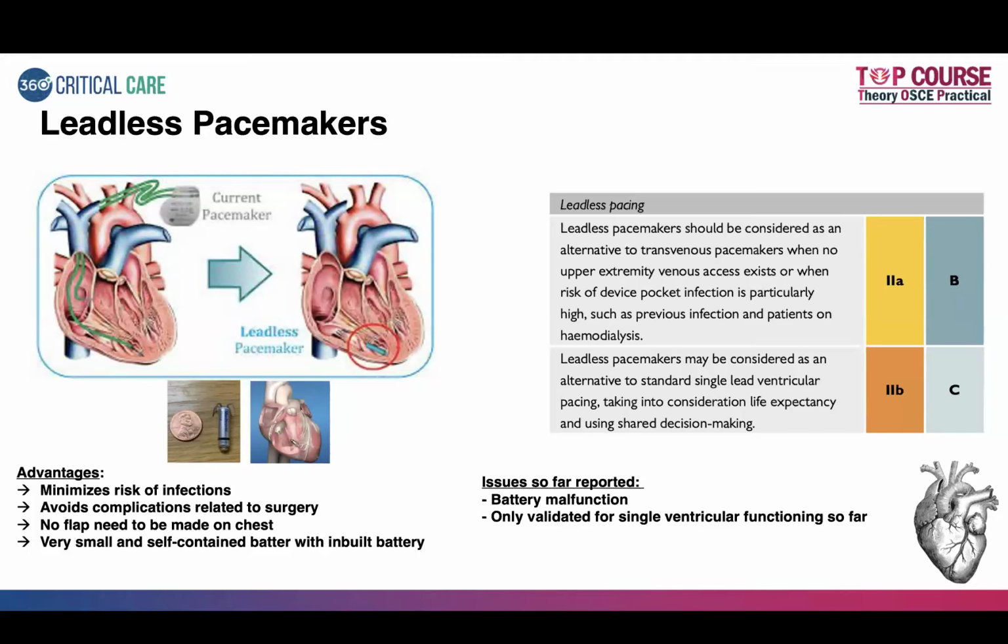And the issues reported so far in all the studies in relation to leadless pacemakers are, one, because it is a new modality, there are only certain studies that have come in relation to this, and they had said that battery malfunction was one problem, and it has been validated only for single ventricular functioning so far.